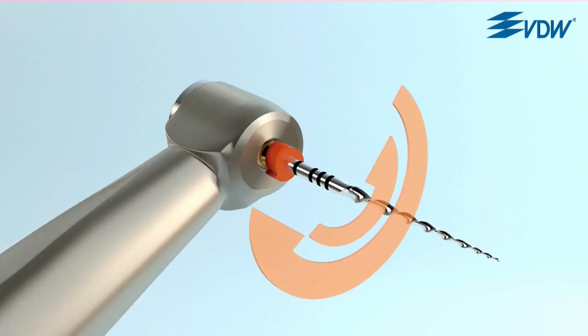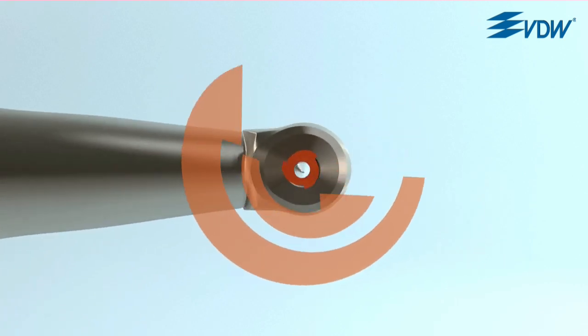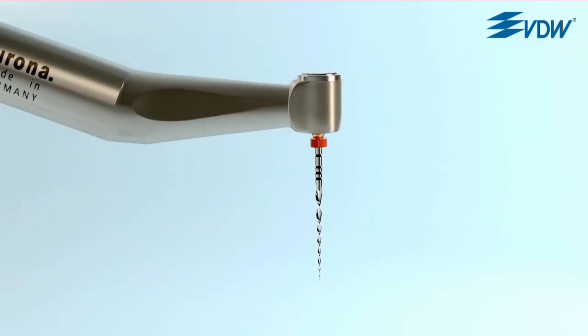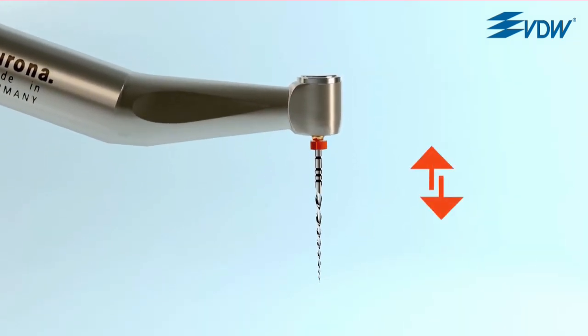At the same time, reciprocation ensures that the instrument stays centred in the canal. The reverse rotation releases the instrument and relieves stress.